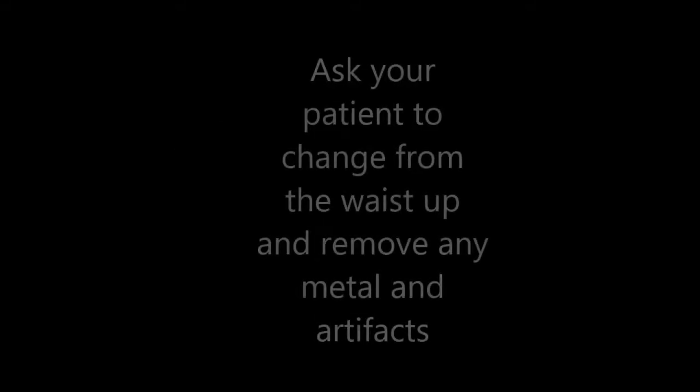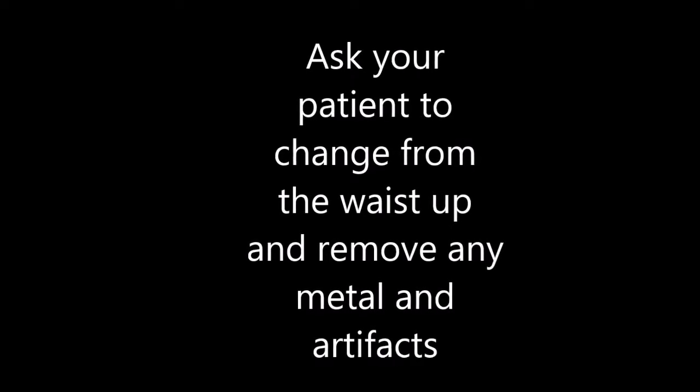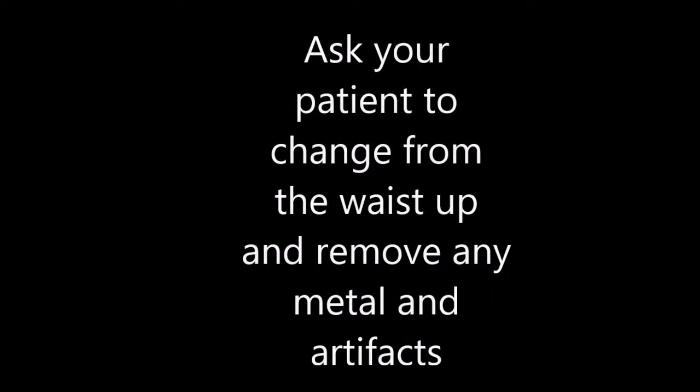If there is no chance of pregnancy, I will give them a gown, have them change from the waist up, and remove their bra, anything metal, and any other artifacts that might show up on the X-ray. In this case, our patient was having right upper anterior rib pain, so we put a nipple marker in the area that hurt the most.